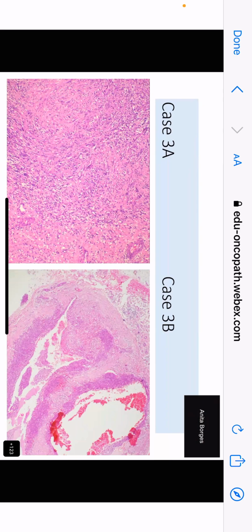And the arrangement of the spindle cells is in? There are fascicles. Yes. So the spindle cells are in fascicles, and once again, a fascicle is a bundle. Disordered fascicles, irregularly arranged fascicles. Yes, but what is a fascicle? Can you define a fascicle, please, Vimi? A fascicle is a bundle made up of elongated cells in which all the cells are running parallel to each other and parallel to the direction in which the fascicle is running.